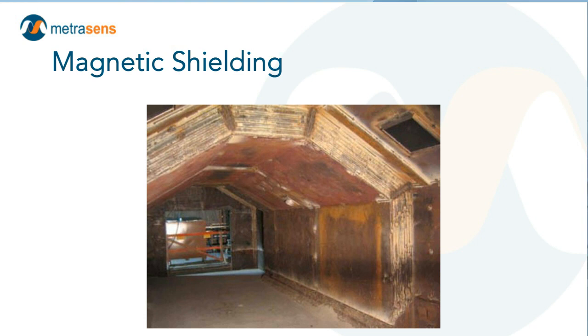What you're looking at in that sort of barn cross-section shape is plate steel, like 1-inch thick plates sandwiched on top of one another. So you're looking at a foot thick, a 1.5 foot thick steel plate. This is for a very high-end research magnet. This is not what you're going to find in clinical MRI.